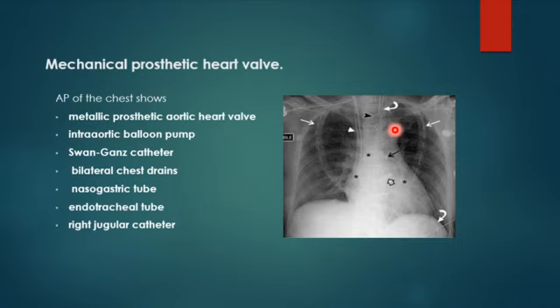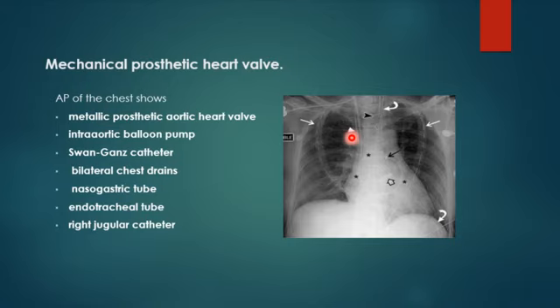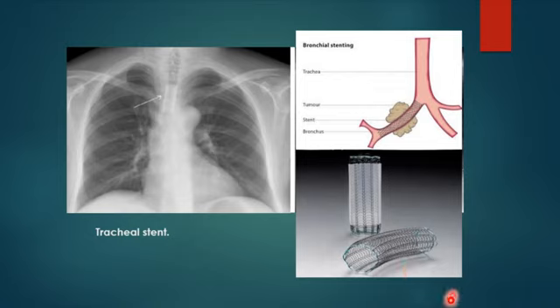This AP view shows a patient with a metallic prosthetic aortic valve. Drawing a line from the left atrial appendage downward, the valve is located above the line with its orifice toward the ascending aorta. This patient also has an intra-aortic balloon pump, an endotracheal tube, two chest drains, a Swan-Ganz catheter with a long loop toward the right side of the heart, a nasogastric tube to the stomach, and a right jugular central venous catheter. Multiple tubes require you to follow each type carefully.